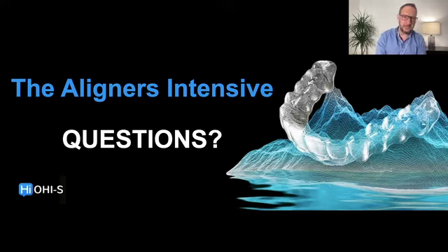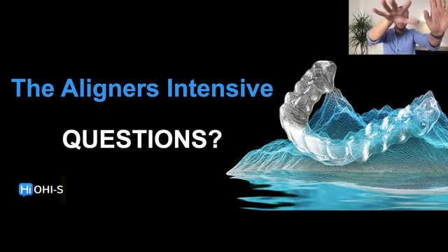If you don't work with DSD, if you don't work with Invisalign, the best way is to use software where you can have 3D controls, where you can change the position of the models, okay? And then take these pictures, or the most complete amount of pictures and videos you can have, to understand the smile of the patient in rest, in the full smile, in the photo smile, and try to equilibrate the position of the model according to the photo, okay?